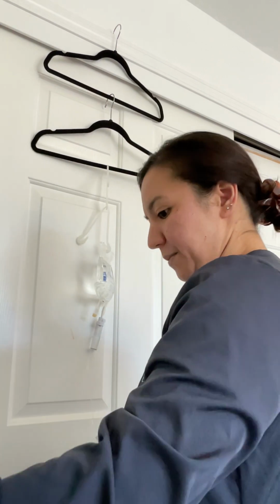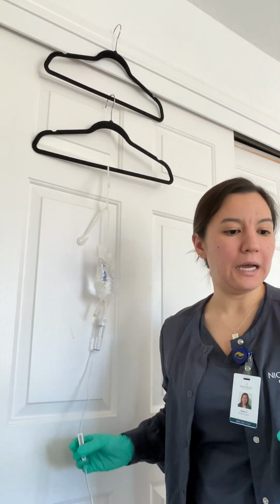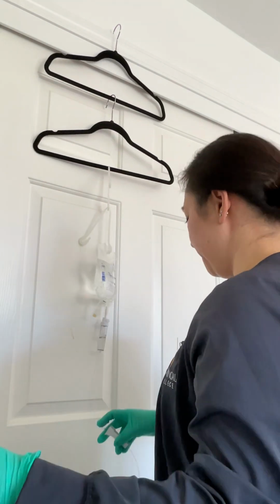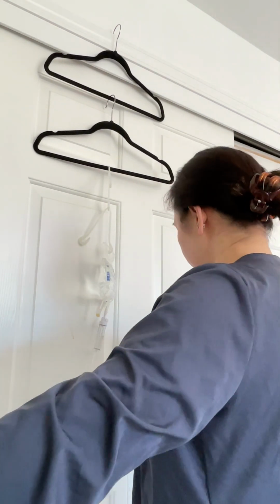All right, now that our tube is primed, we're going to go ahead and do our drip factor. So this fluid would be 38 drops per minute. So we're going to count for a full minute and just count the drips that are going into the drip chamber.